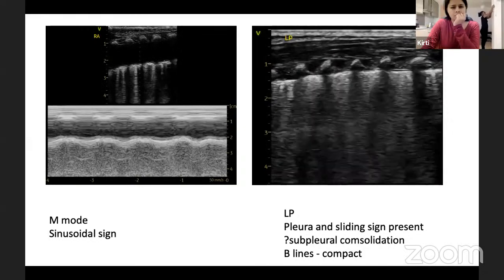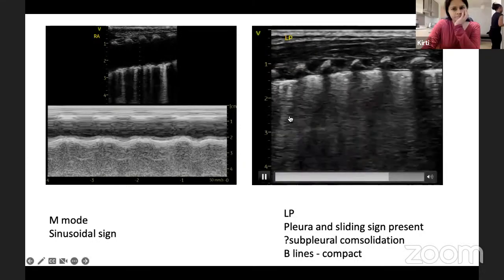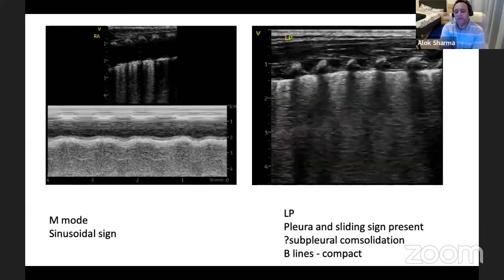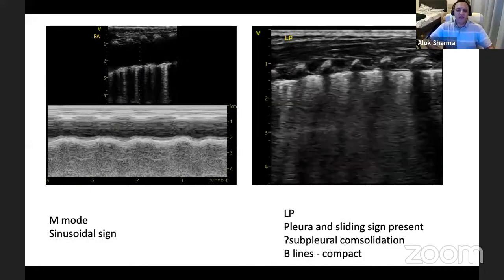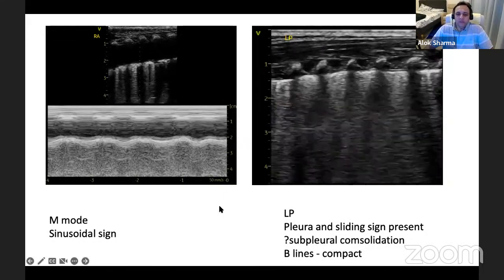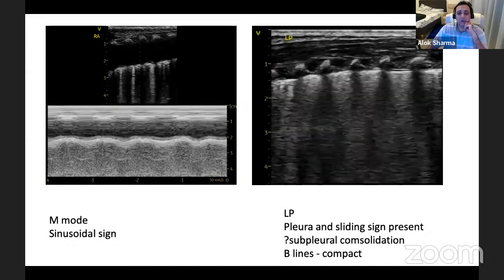So, your collection is about a centimeter. If you look at it, it's not massive at this particular point. And when I look at your next slide, it's barely there. So the larger the effusion, the more dark you'll find the image, because the parietal and visceral pleura will not be moving much on top of each other. So in terms of reflection of sound waves, you're still getting a little bit of a shimmering effect where you get that dark area. But it's a beautiful sinusoidal sign. I wouldn't be able to get this better myself. But again, really nice depth. And again, the beauty of using a probe with a frequency of 8. Well done. Very good. Thank you.